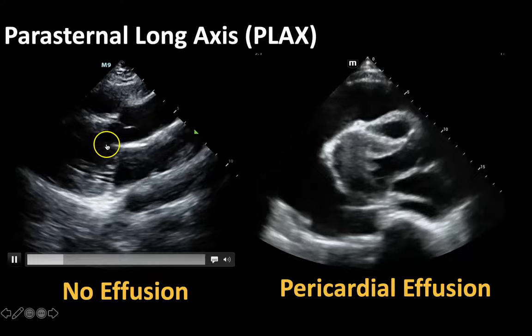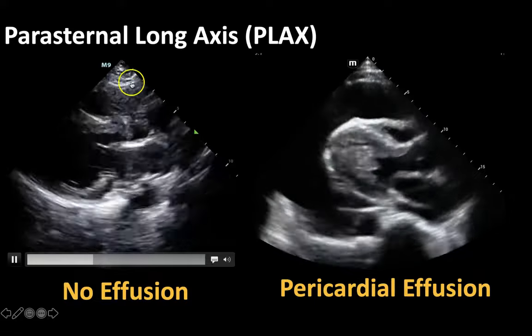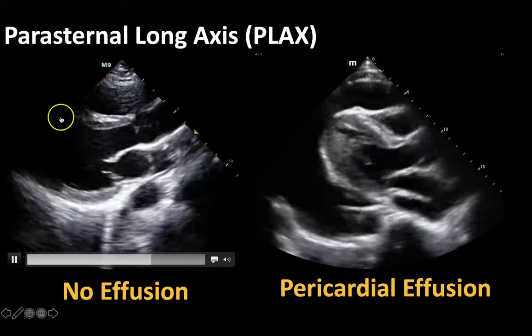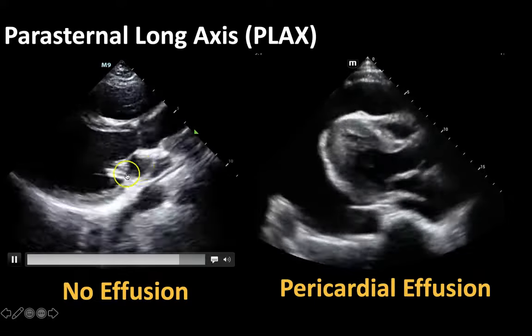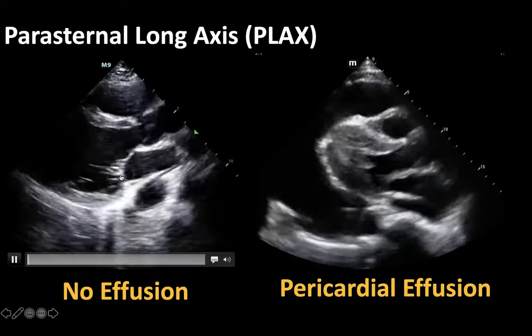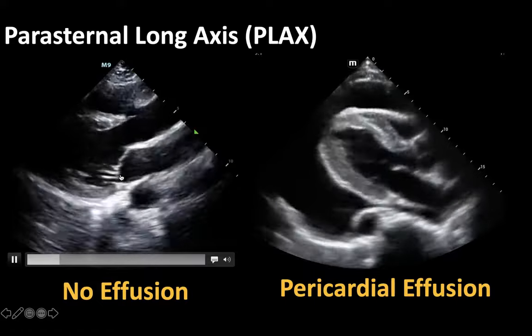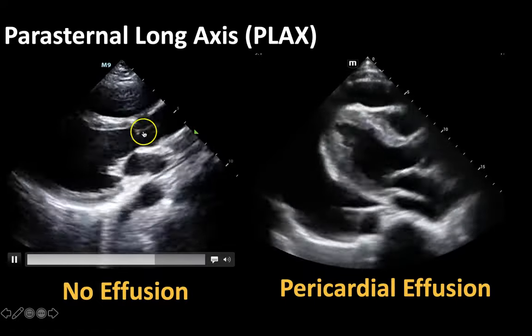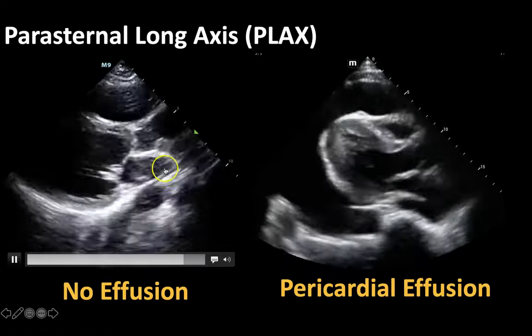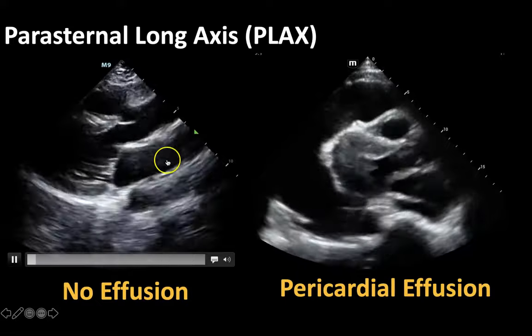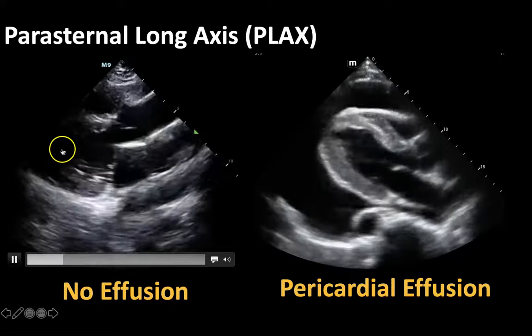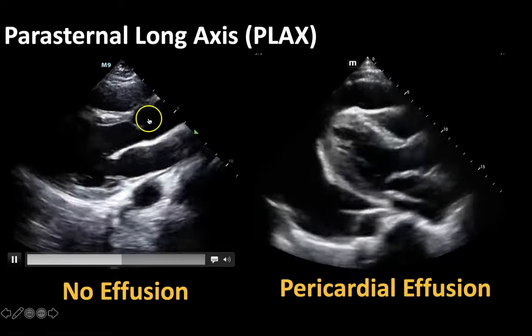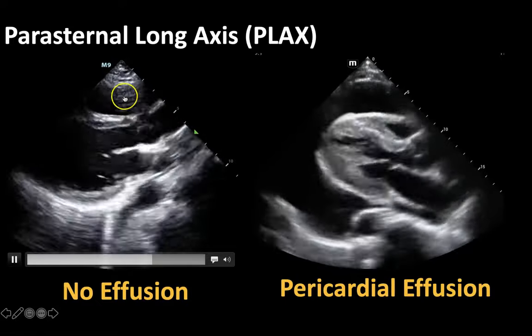This is your parasternal long axis view, the same normal view we just had. Here's your left atrium, your left ventricle, your aortic outflow tract, and your right ventricle. When we're looking for an effusion, we want to look outside the heart in that pericardium for that black fluid.